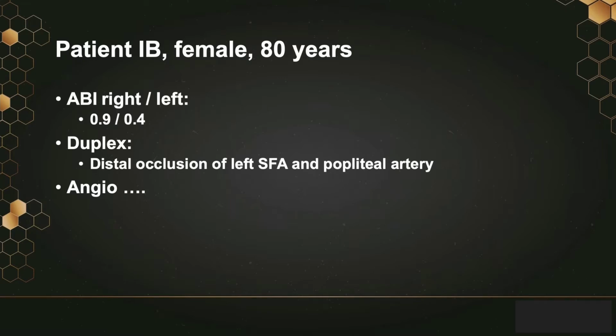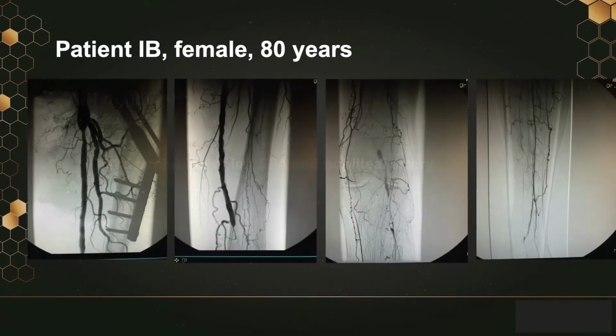And now I'm presenting you the angiogram. You can see during this surgical reconstruction, there was a TEA of the left common femoral artery done. There is a moderate lesion at the origin of the SFA persisting. Then we see the occlusion of the distal SFA and proximal popliteal segment. We don't see a stump of the former venous bypass.